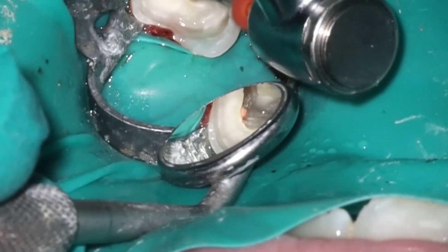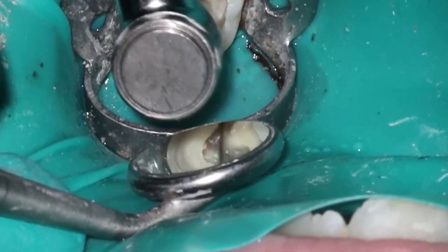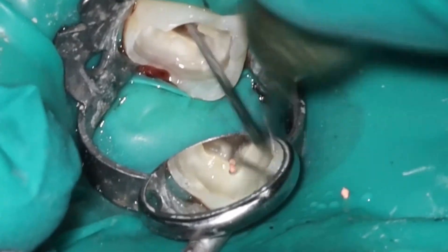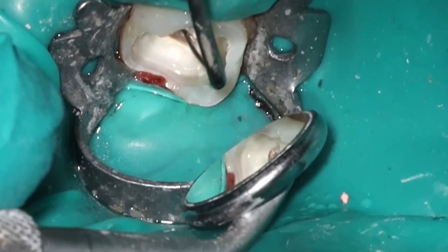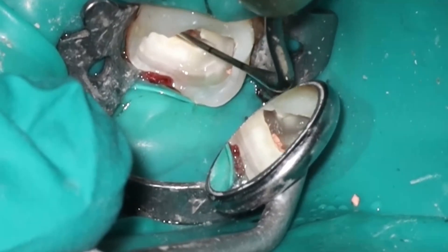One thing with the Pac-Mac here: because of that curve, you'll notice I'm only going in about maybe two to three millimeters. I'm not dropping down to the normal third of the canal length that I normally would. That's because if you put a Pac-Mac around a curve, it's going to break. Ask me how I know — it happens more often than it should.